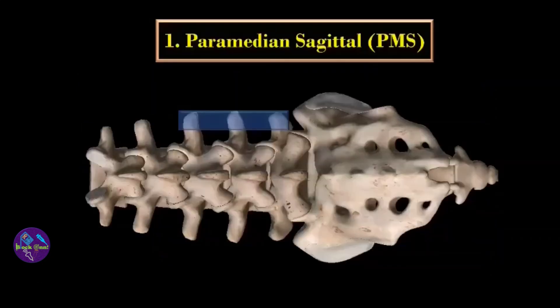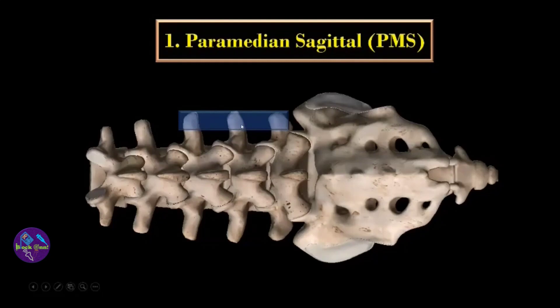Coming to the paramedian sagittal approach, we place the probe just over the transverse processes of the L3, L4, and L5 vertebrae. You can start scanning from the midline — identify the spinous process, then the lamina, then the articular process, and then the transverse process, just as you do while scanning for neuraxial blocks.